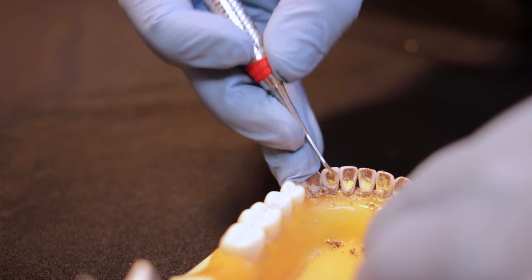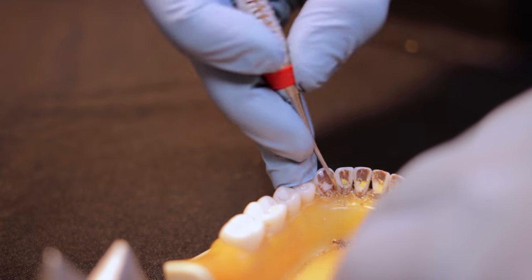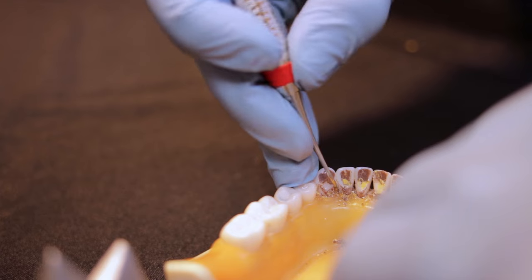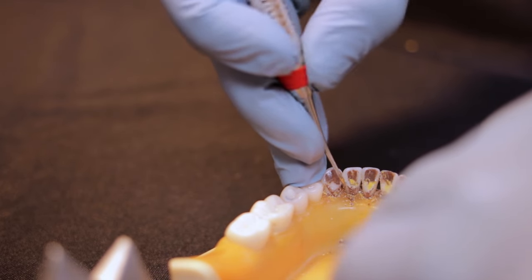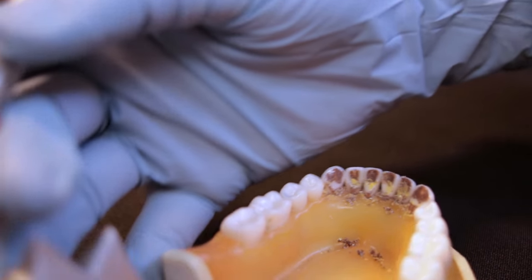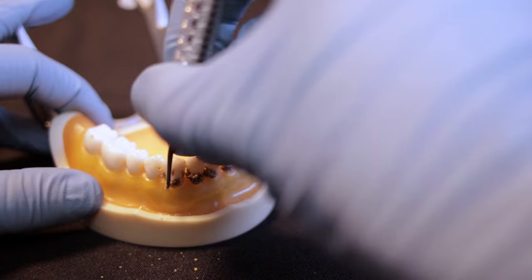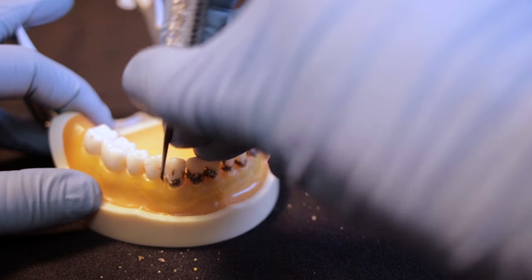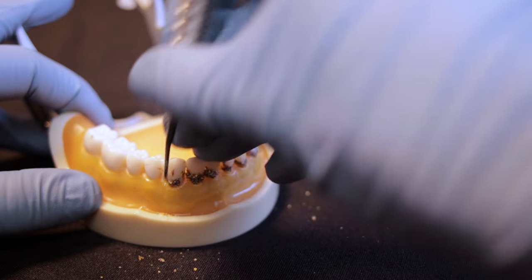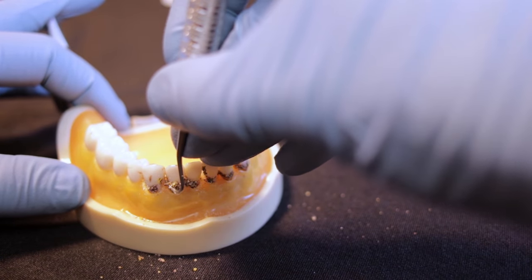Use nice overlapping strokes and have your patient turn as you go from tooth to tooth — towards you, away from you, whatever you need in order to get the job done. Then we're going to finish up with the surface towards us on the facial side, and after that we should have all of the interproximal surfaces done.